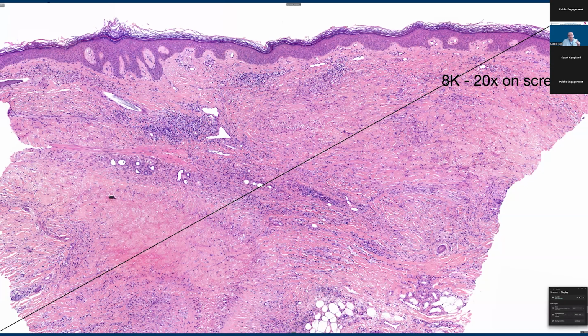And if you look at this on a 55-inch monitor from about 70 centimeters, you will see everything you need to make up your mind, and you don't have to move around, zoom in or zoom out. That's why digital is great.